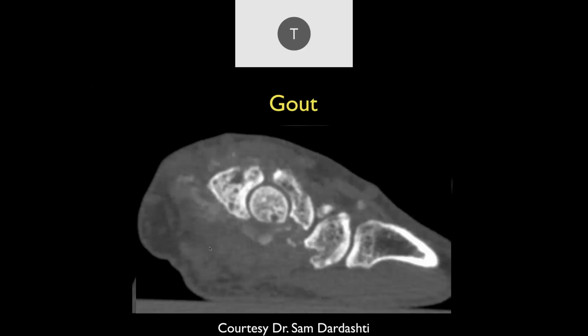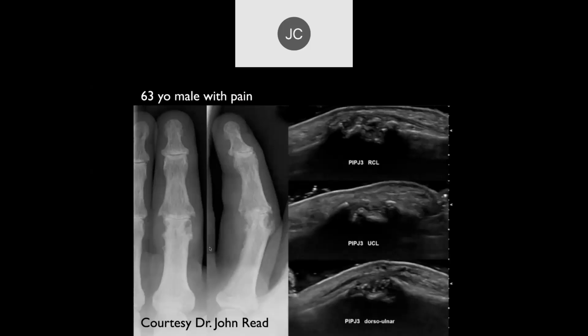And again, if you have CT, if you have a dual energy, you could confirm it by just doing a dual energy scan. And remember, gouty crystals and the bone really absorb the radiation at different frequencies, so you can differentiate the two and actually come up with a scan just of the urate crystals separate from the calcium.